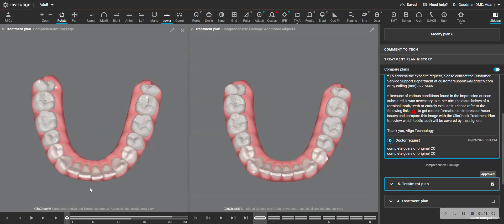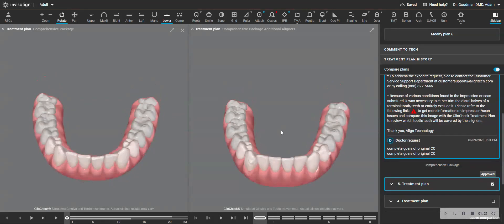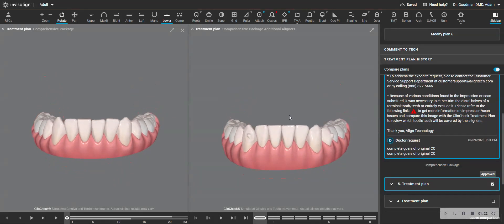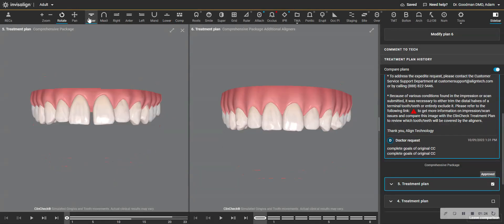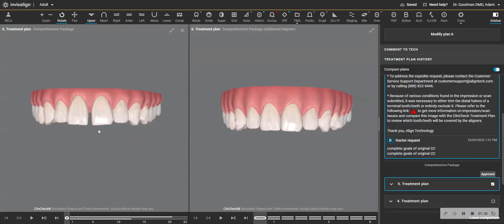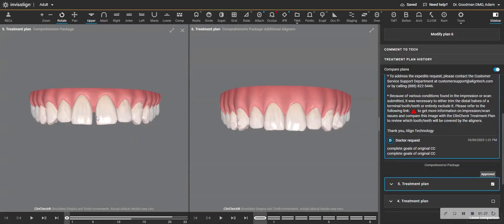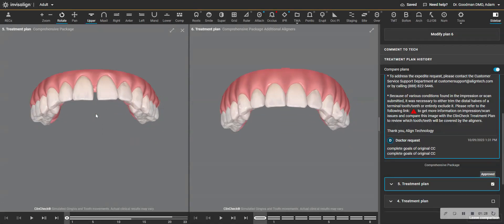Now, this one tooth that was originally out just needs to nudge in a little bit more. So we need a tiny bit of refinement there. Now, the front gap has closed all the way.